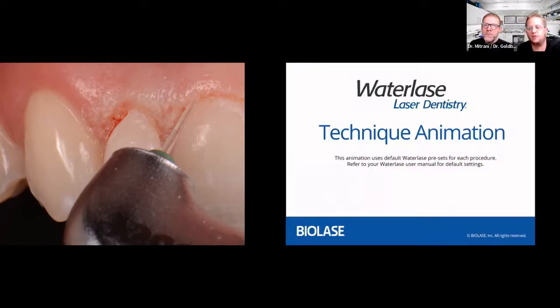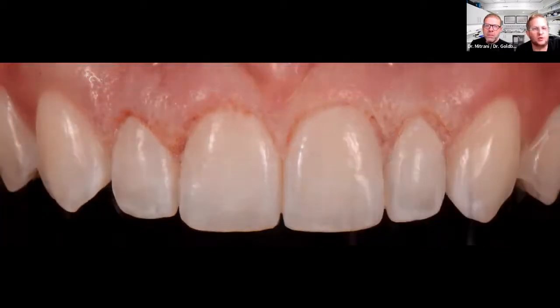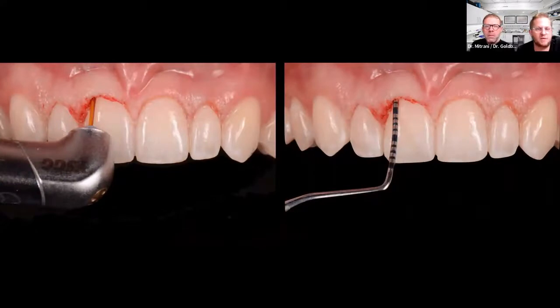And once you're done with that, you're going to smooth all the area of the bone, and you're doing it with a closed flap technique, and that makes it much better for the patient's post-op as well. And so here's where we've heard it gets tricky for some. It's very important, as there's the bone recontouring, to go in with a burr and make sure that that ledge of bone is both thinned, but we also have enough thickness to allow for that biologic width to have the right amount of tissue there.